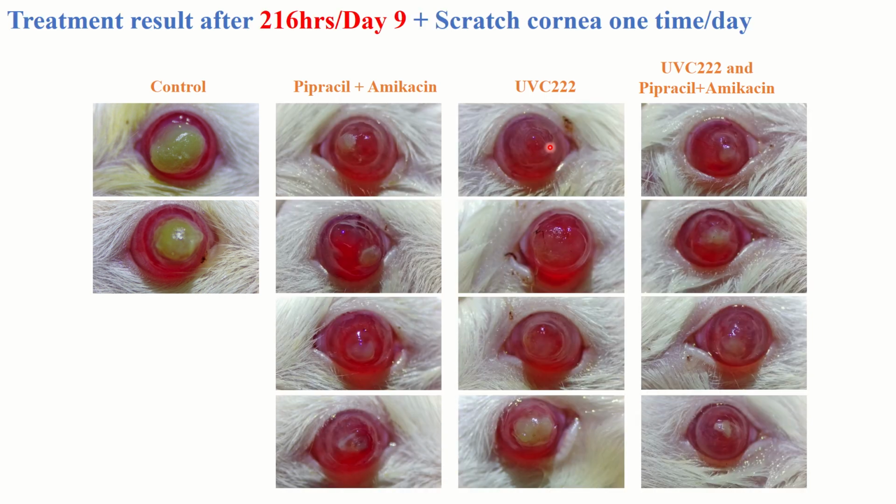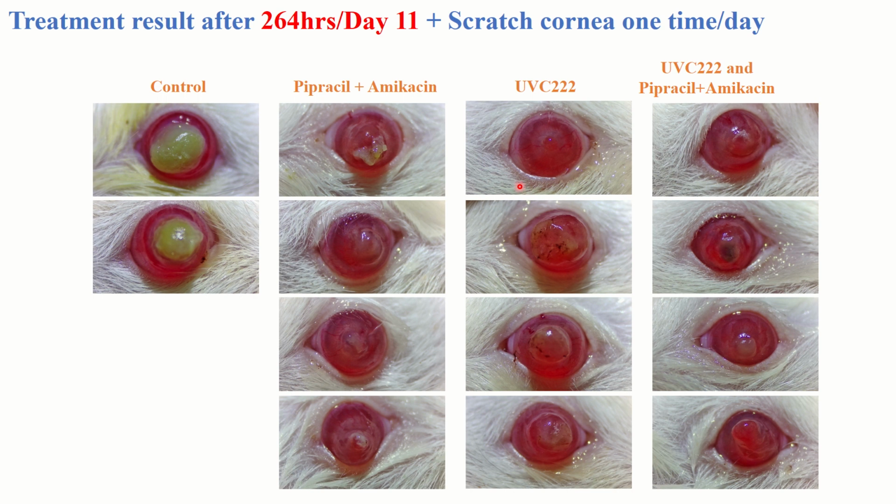This is the treatment result on day 9, where we again did the scratch every day. This is the result on day 11. Here again you can see that day by day the morphology of the eye looks very clear.